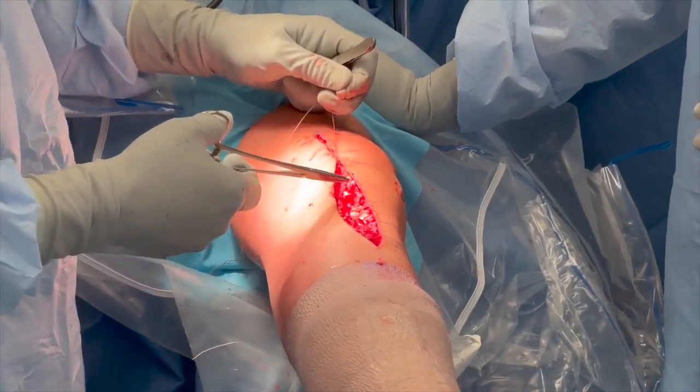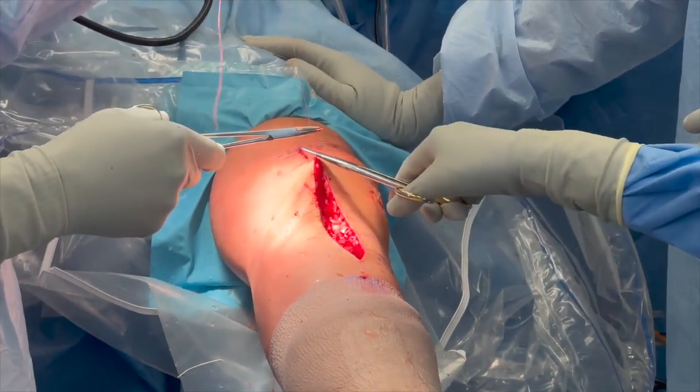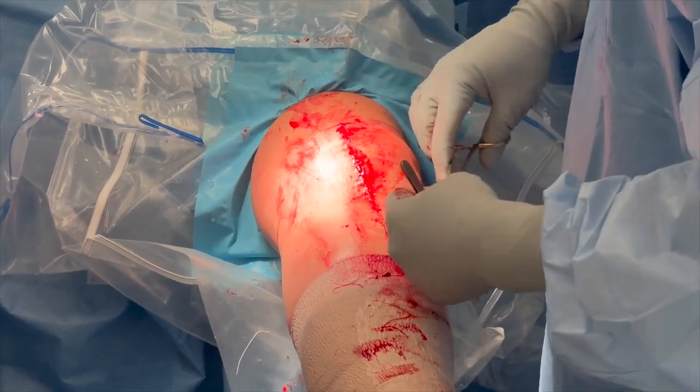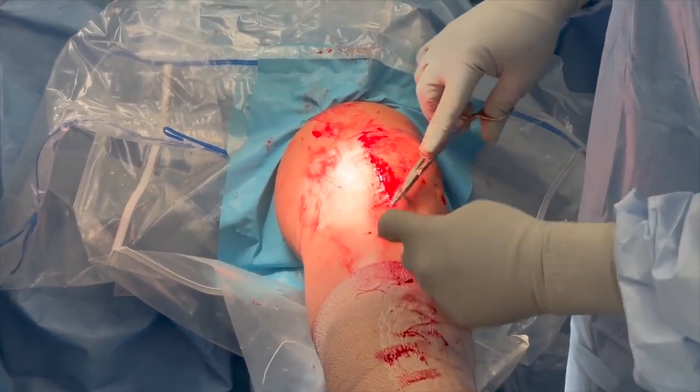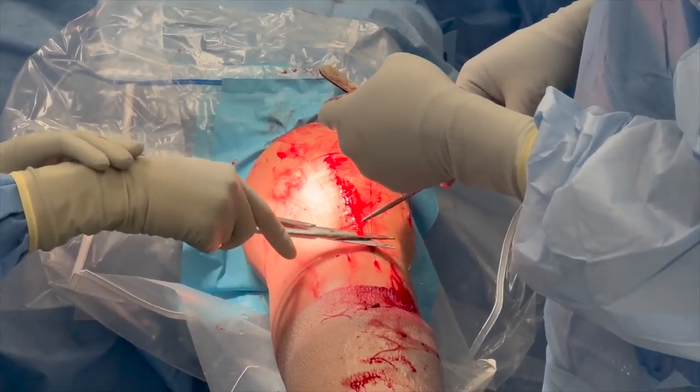After the heterotopic bone has been removed, lysis of adhesions has been performed, and the posterior capsule has been released, a final manipulation of the knee is carried out. The deep tissues are then closed with sutures, and steri strips are loosely applied along with the sterile dressing.